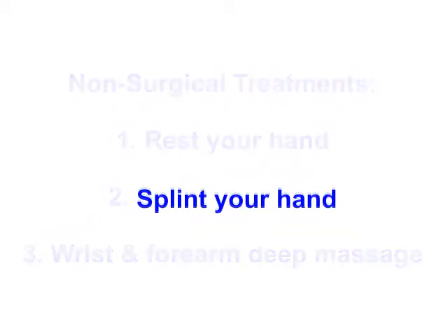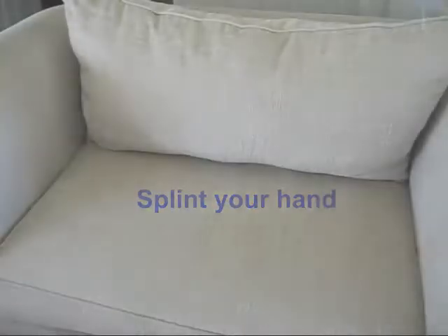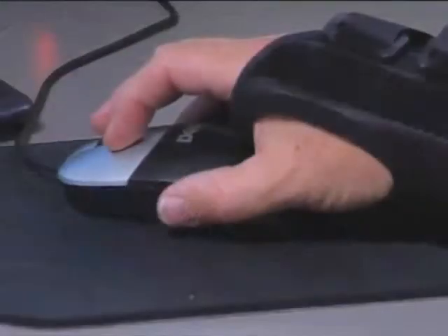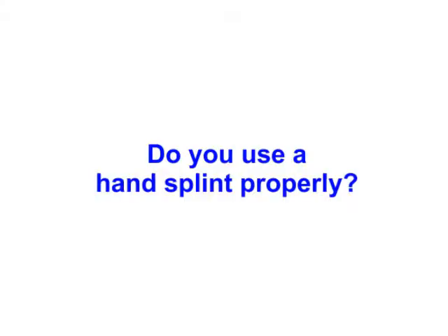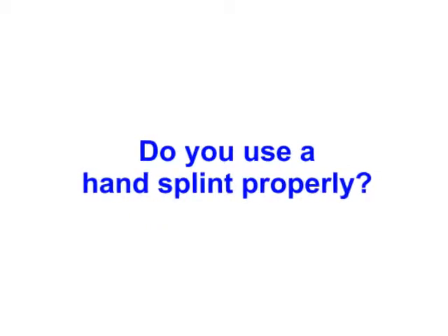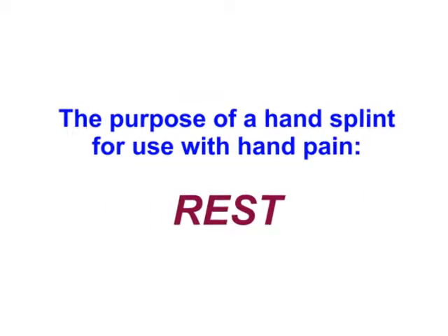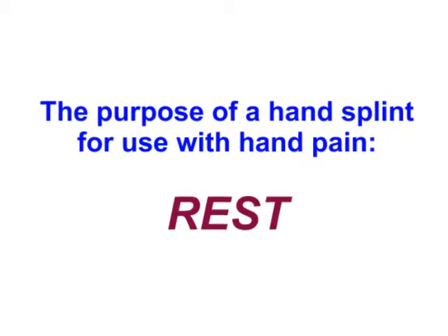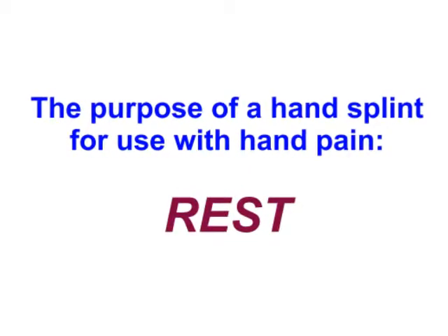Splinting your hand can be extremely useful, but you probably already own a number of splints that don't seem to do much good. Do you use a splint but your hand still hurts? If so, the reason for this is quite simple, and that's that you're probably using the splint wrong. Actually, most people don't use a splint properly because they don't realize that if you have hand pain from carpal tunnel syndrome or wrist tendonitis, the sole purpose of a splint is to allow your hand to rest.